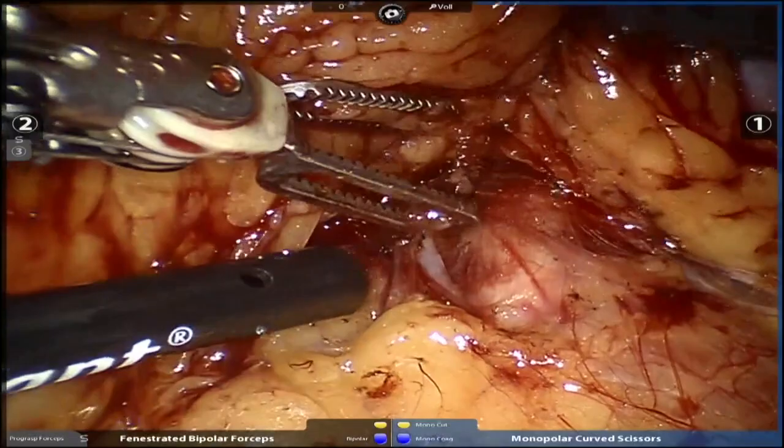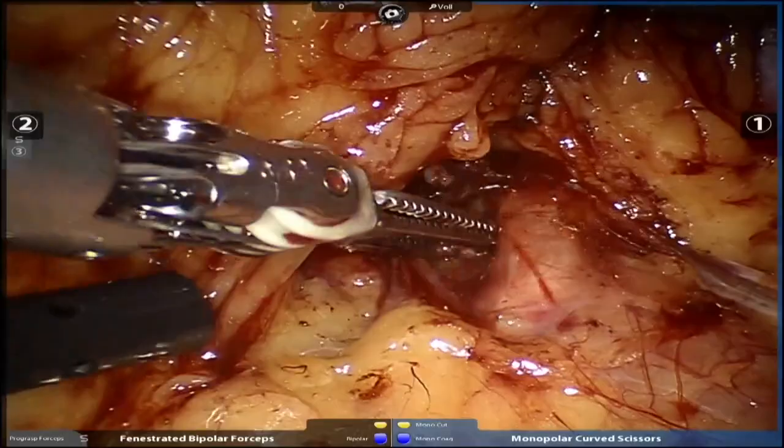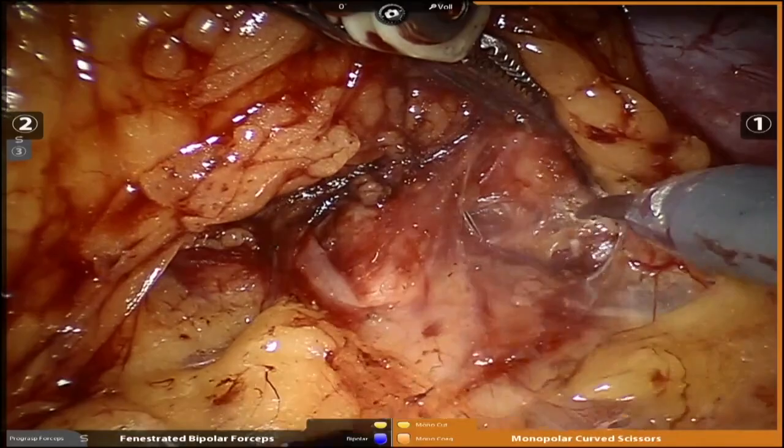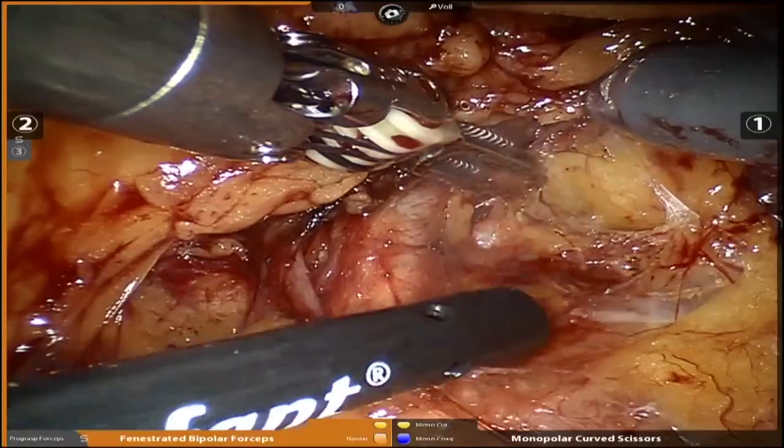Yeah, but it's not really a problem to find the artery anyway. But that's a big advantage of the retroperitoneal approach. I would say some people that are early in their experience retroperitoneally may not be able to find the hilum well, and then you can use the cava. You can find the cava and just walk up cephalad on the cava to find the artery. So that's a nice trick if you're not sure where the artery is. It's not hard for you, Gunter, because you've done a million cases, but for people that are just starting retroperitoneally, it can be challenging.